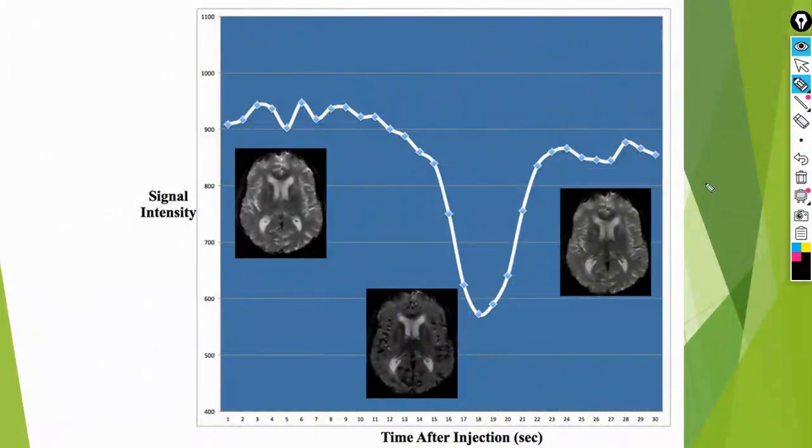This is the contrast agent. Let's focus on it together. I injected my contrast agent. I always take the contrast agent for T1 imaging. I always see if the tumor is illuminated or not in T1, if I am using the contrast agent.